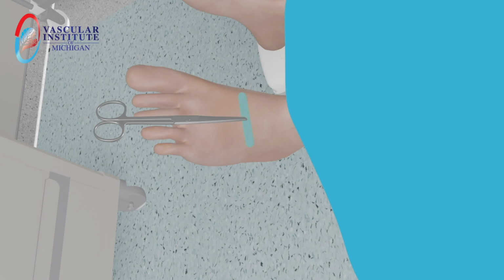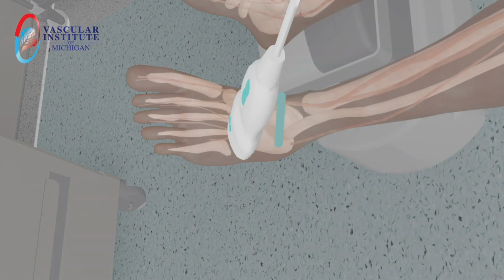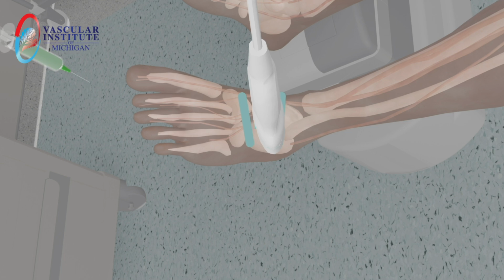Firstly, the skin around the foot is marked based on the upper and lower margins of Dorsalis Pedis Artery. Then the location of Dorsalis Pedis Artery is picked up using ultrasound. The skin entry site is numbed by injecting lidocaine.